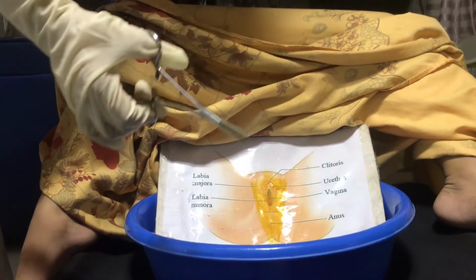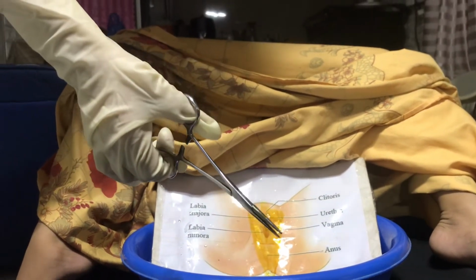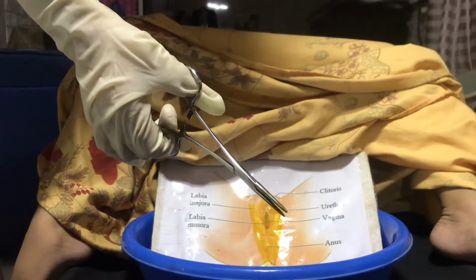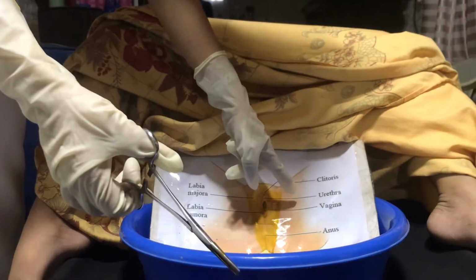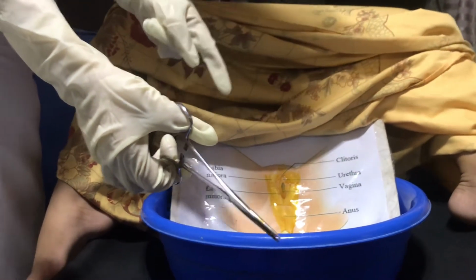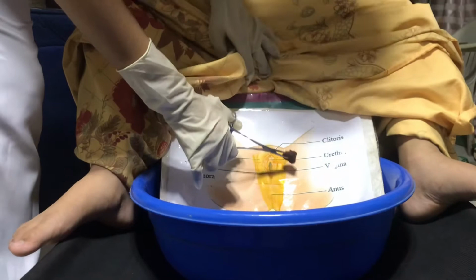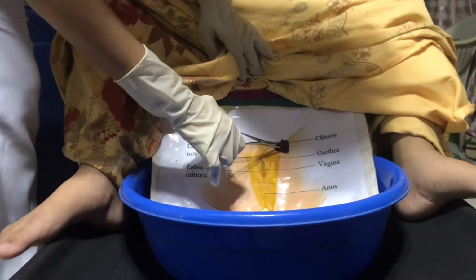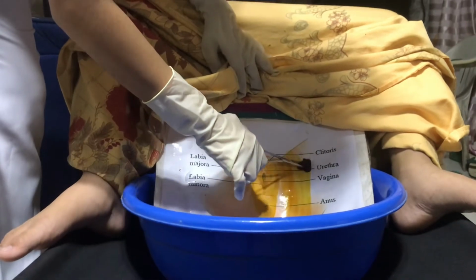Next is the sixth cotton ball. With another cotton ball, cleanse the groin starting from the groin up to the thigh. Use another side of this same cotton ball for the near groin. So that's the sixth cotton ball, in a zigzag pattern: up, down, up, down.